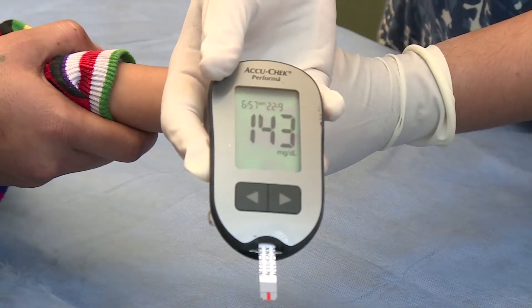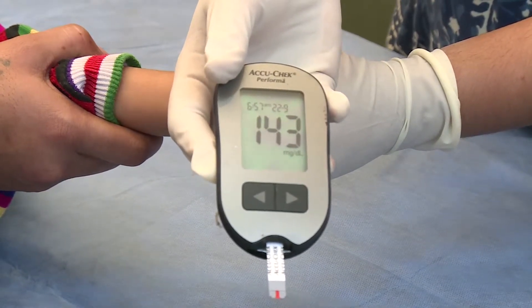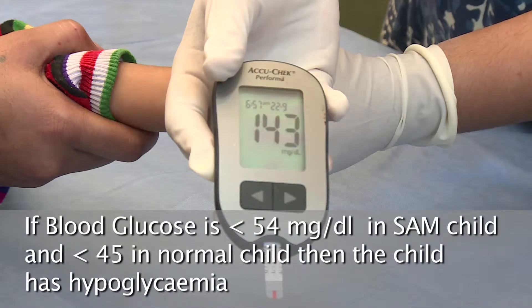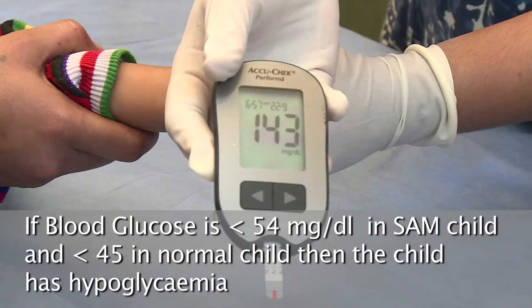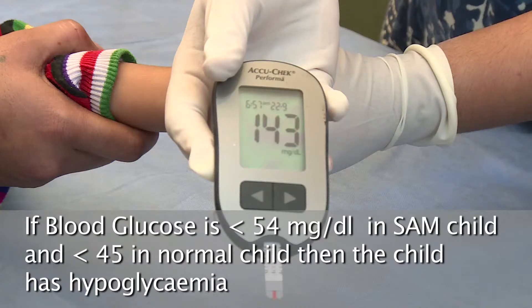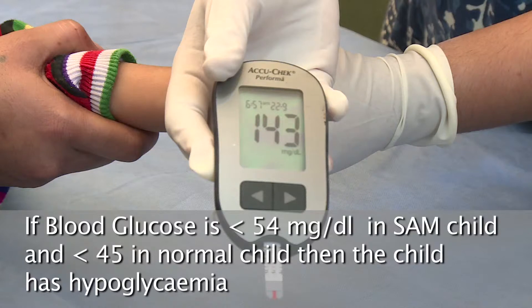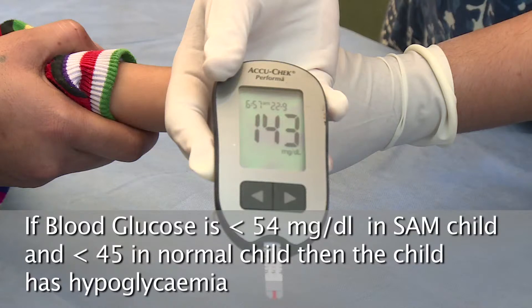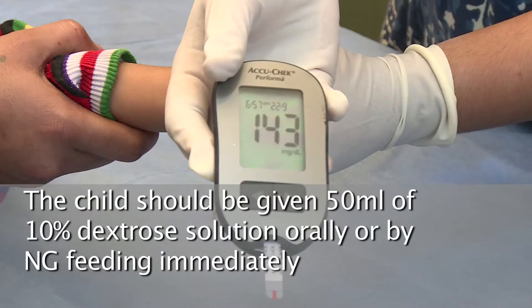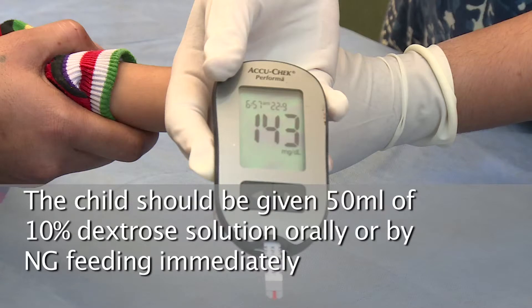Record the blood glucose level. If blood glucose is less than 54 milligrams per deciliter in children with severe acute malnutrition, or less than 45 milligrams per deciliter in a normal child, they are said to be in hypoglycemia. In this case, the child should be given 50 ml of 10% dextrose orally or by NG feeding immediately.